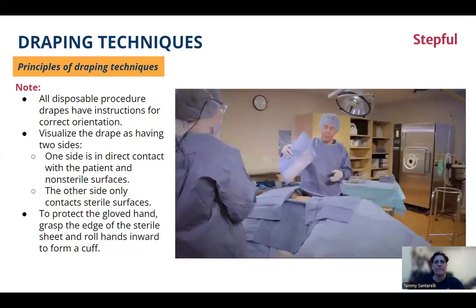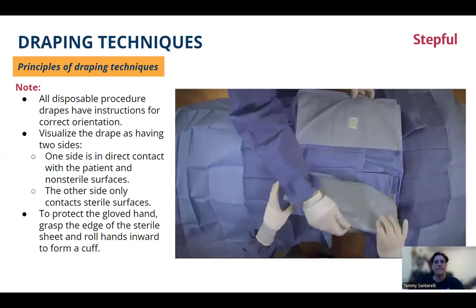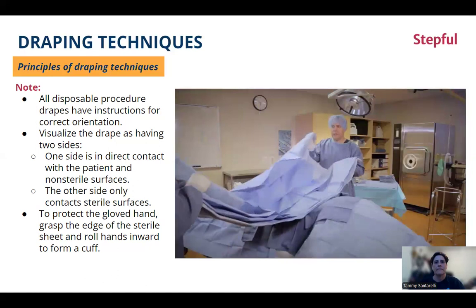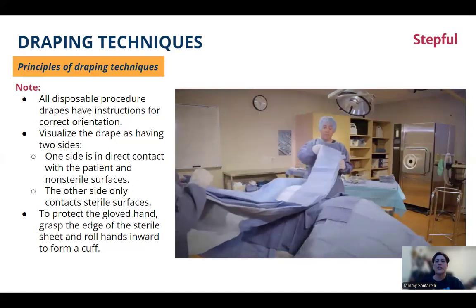So I'm going to place this right at the incision site. We're going to unfold it. The surgeon is going to grab one side. I'm going to grab the other. We're going to cuff our hands and extend. Good. And then they just drop it.